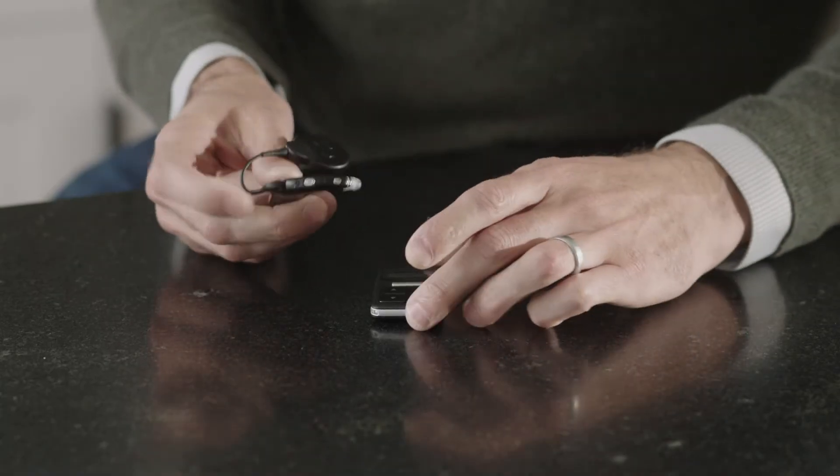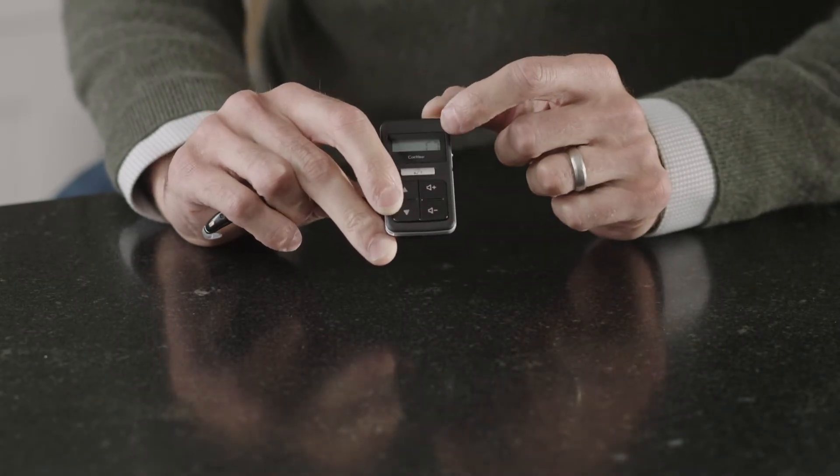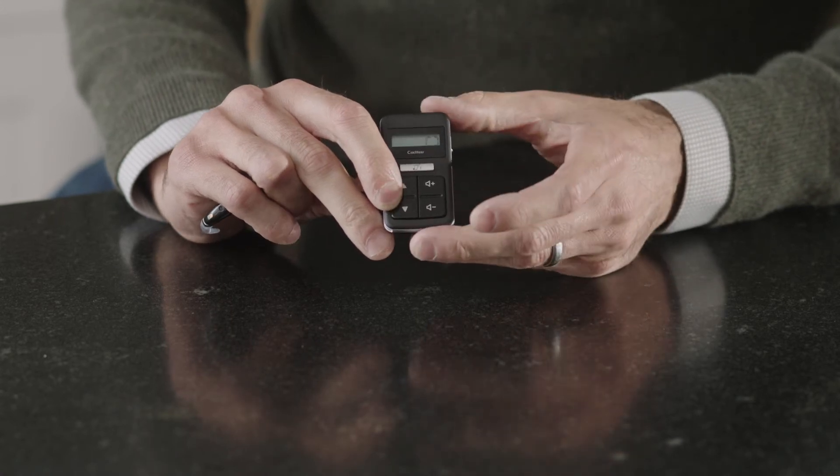Ensure both the remote control and the processor are turned on. Take the Nucleus 7 sound processor coil and touch it to the back of the remote control. You'll see an icon on the LCD screen indicating pairing was successful.